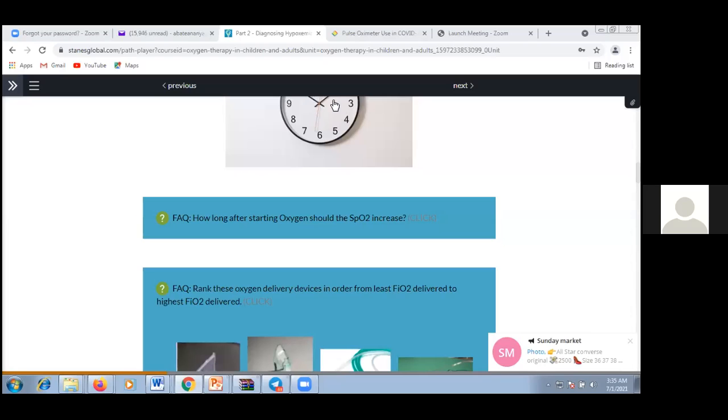Someone says 1 to 2 minutes, 1 to 3 minutes. Dr. Hussein says it depends on the severity of the underlying lung condition, within a minute. 3 to 4 minutes. So I can agree with all of you. The consideration is latency. When you say latency, within how many seconds or what time frame can the pulse oximeter detect a pulse and measure oxygen saturation is one thing.